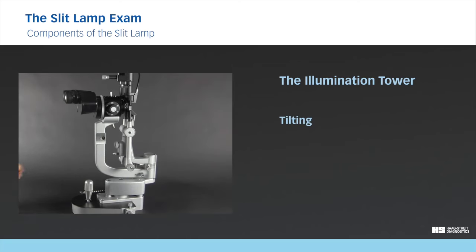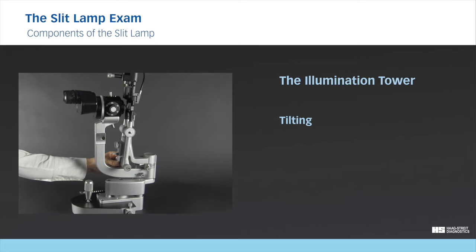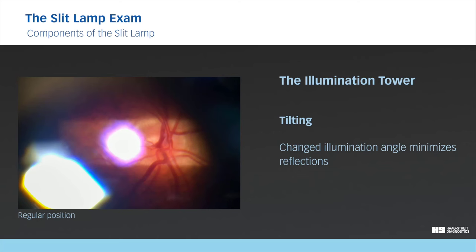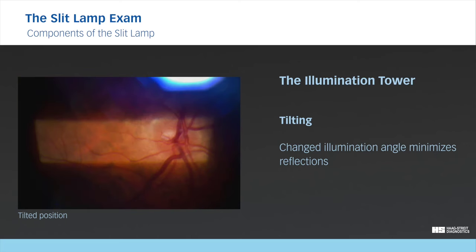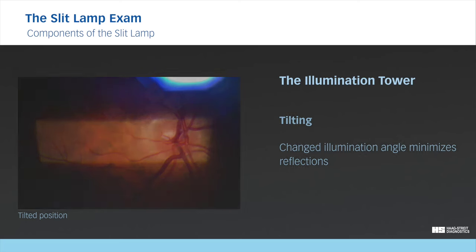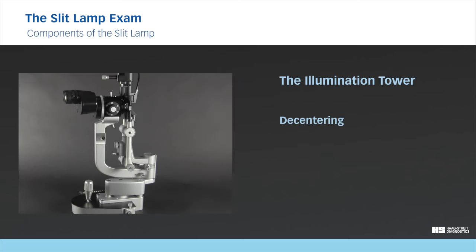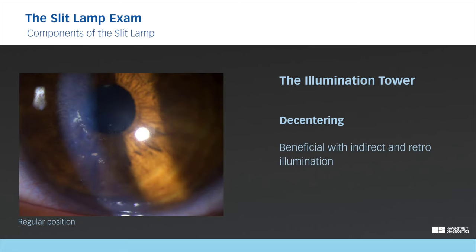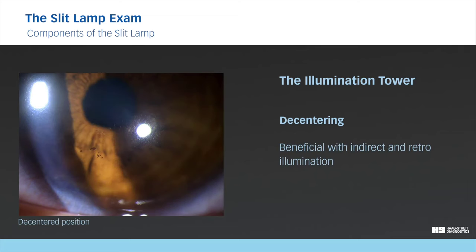Modern slit lamps feature an option which allows you to tilt the illumination tower and therefore change the angle in which the slit is projected on the eye. This can be used to minimize reflections from the preset lens when examining the retina. De-centering the illumination tower decouples the shared plane of focus of the illumination tower and the observation system, which can be beneficial for examinations with indirect illumination and retro illumination. Remember to restore centering after examining.